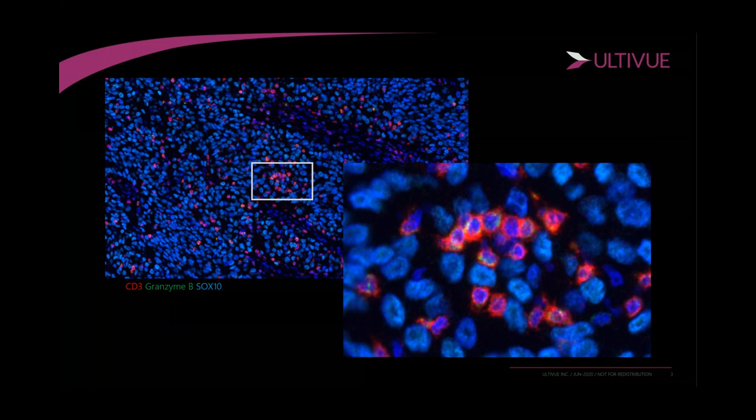Those markers by themselves, if we were to use them in a DAB assay, would only give you those answers separately, and it may not give you enough information. But when you combine them together, you're able to functionalize and get a lot more data out of your sample.